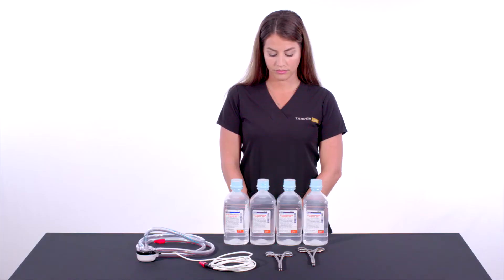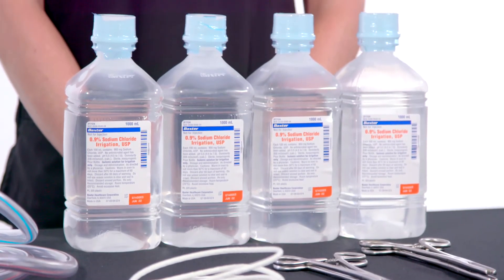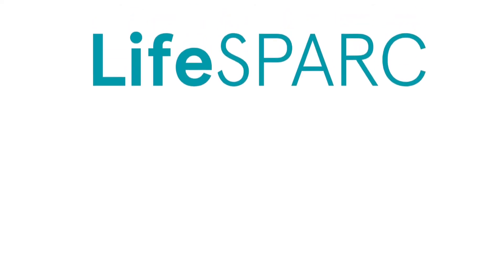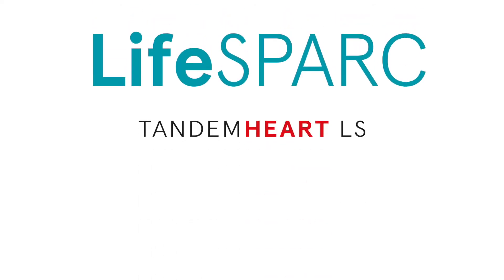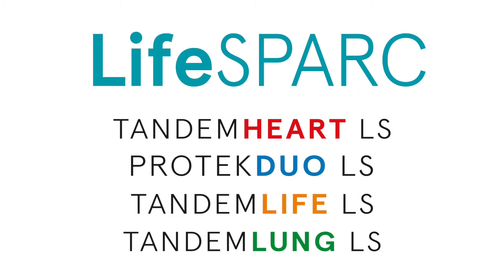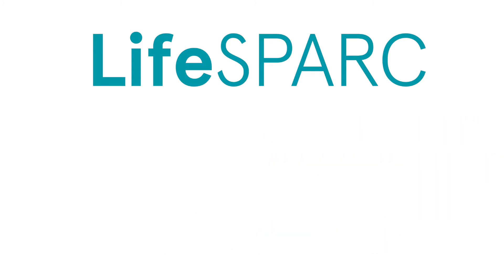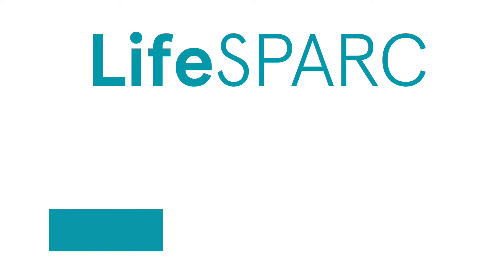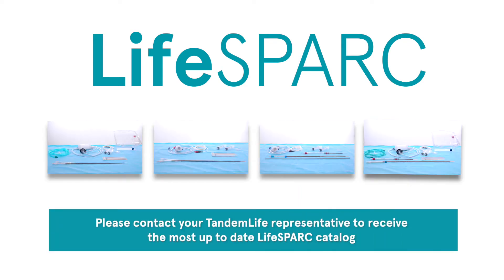To enable effective pump priming and de-airing, user-supplied equipment such as tubing clamps and sterile saline should be ready and available prior to device implementation. The LifeSPARC system can be used with the Tandem Heart, ProtekDuo, Tandem Life, and Tandem Lung product lines. Each product is packaged in a convenient procedure kit box, available with a variety of cannula French sizes and lengths. Please contact your local Tandem Life representative to receive the most up-to-date LifeSPARC catalog.